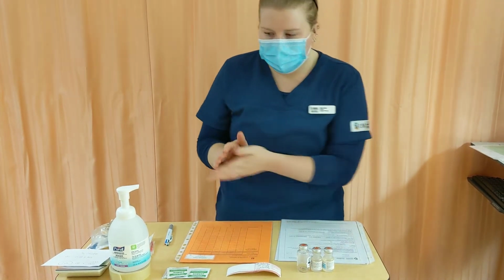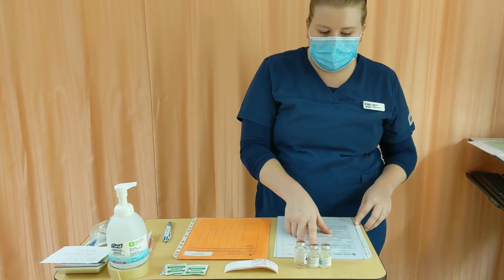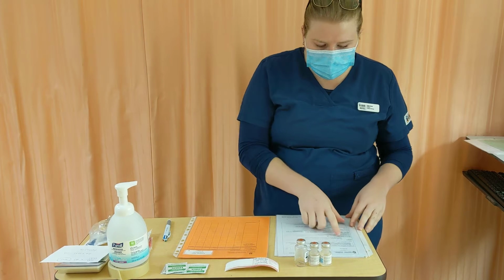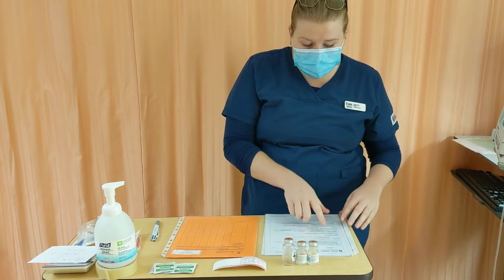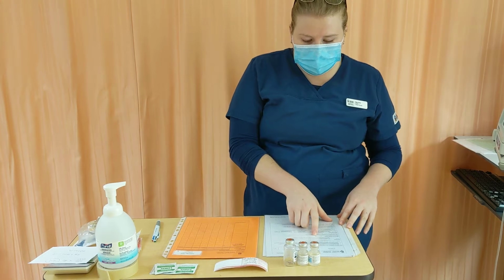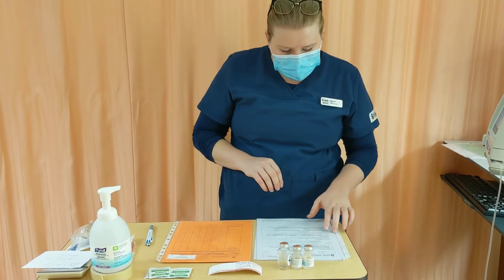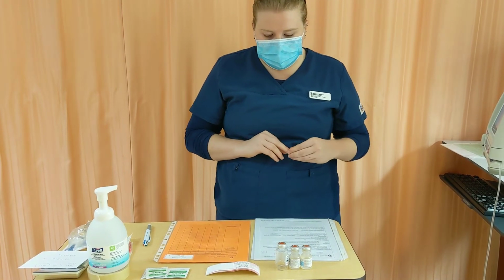So after I've done that, I'm going to wash my hands and go over my PDM. We have Vancomycin. I'm just going to take note that it's a vesicant. It's an antibiotic. It can be given by a student nurse, so I can go ahead and give this. Usual dose, so I've weighed my patient and we're giving a safe dose for this patient. Maximum single dose 3 grams and maximum daily dose 6 grams. We're not exceeding that. It's supplied as a 1 gram vial, so 1 gram at 20 mLs for reconstitution, final volume of 50 milligrams per ml.